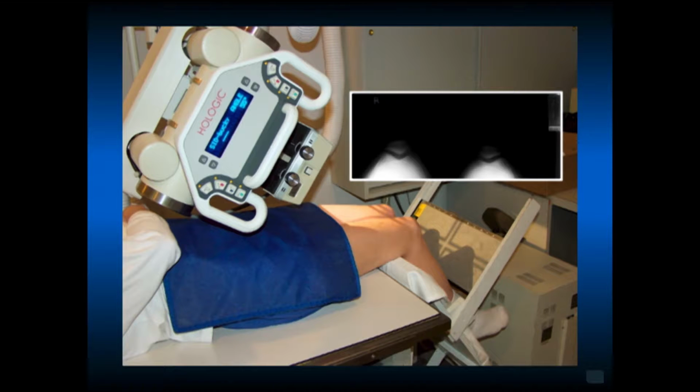This is how a sunrise or merchant patellar view is done. Typically we do bilateral x-rays so we can compare what the trochlear groove depth is, what the patella actually looks like. The development of the patella reflects the groove. So this is a normal merchant sunrise view, and this is the jig that we use to do this.